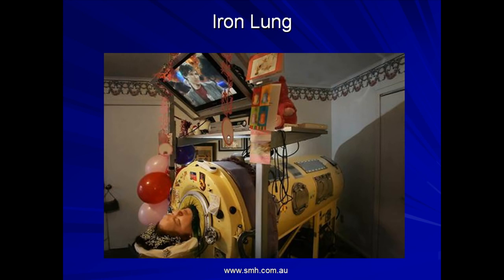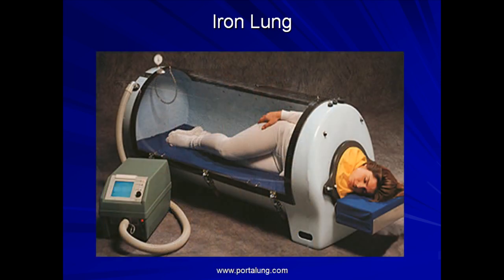While they are quite rare these days for reasons we'll get to, iron lungs no longer need to look like a contraption from a Jules Verne novel. Here is a picture of a modern negative pressure ventilator known as a port-a-lung. And no, I'm not kidding about that amusing name.